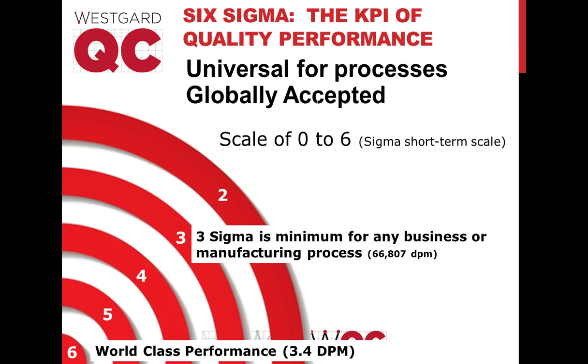And within healthcare, if we look at our laboratory, below 3 Sigma is really where we start to see labs and tests that are going to be repeating their controls frequently, recalibrating a lot of the time, troubleshooting multiple times in a month and calling up their technical support. And really, it's just a lot of extra activity, a lot of burden that a laboratory has to shoulder when they have a test that is so low in quality.